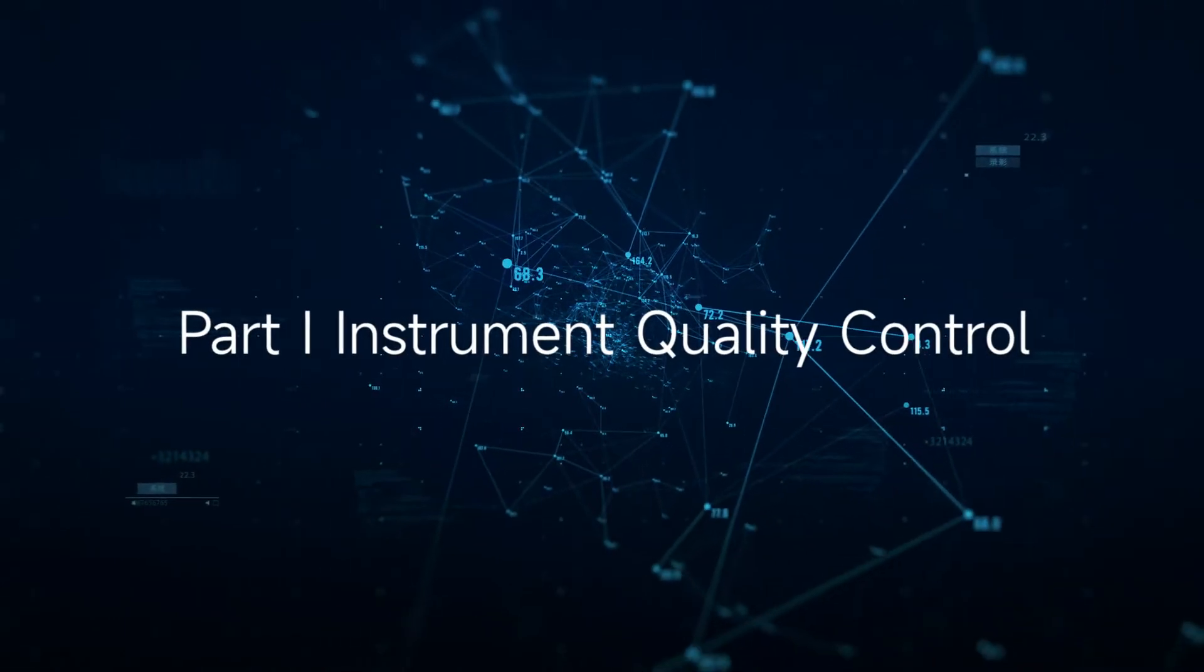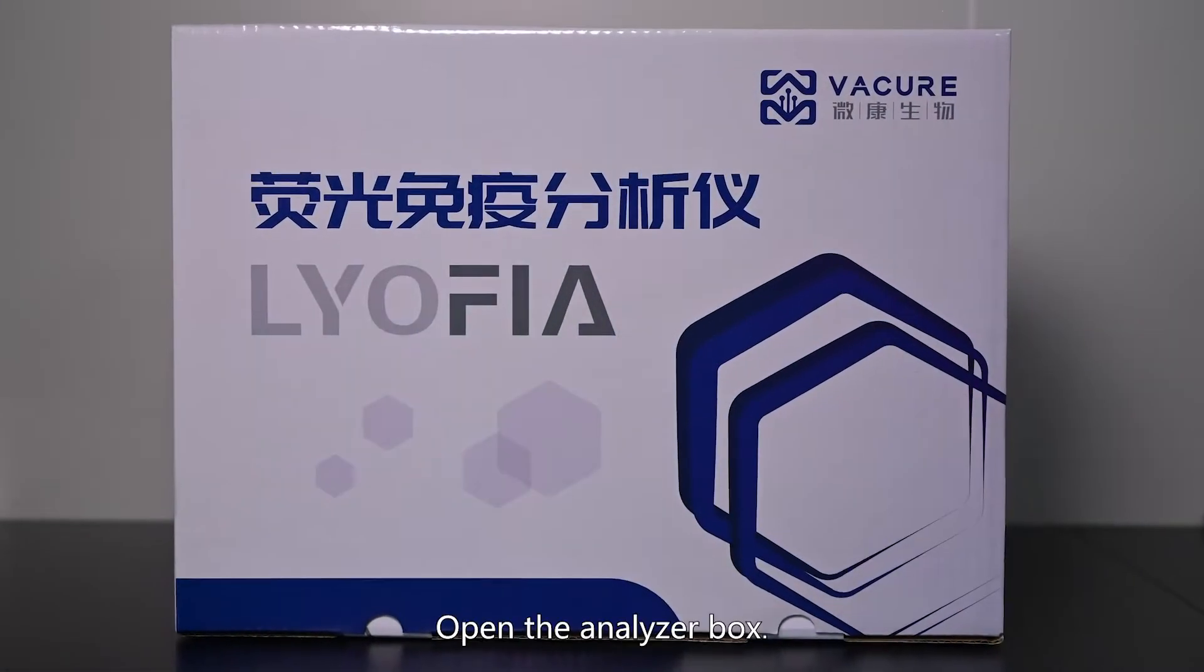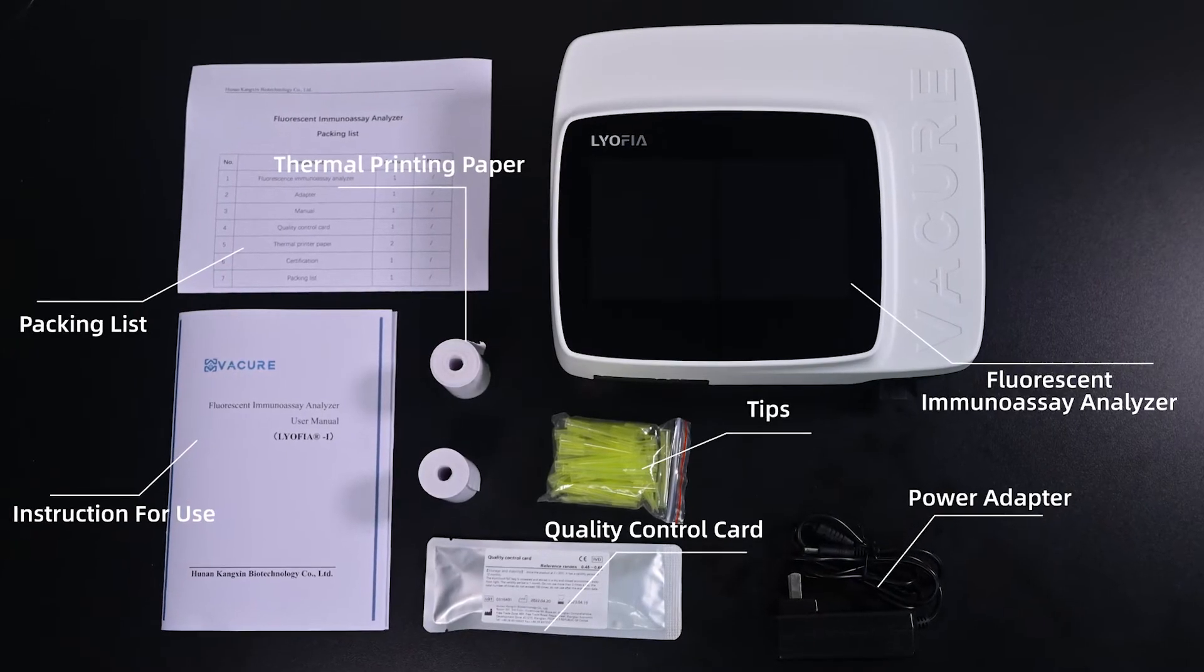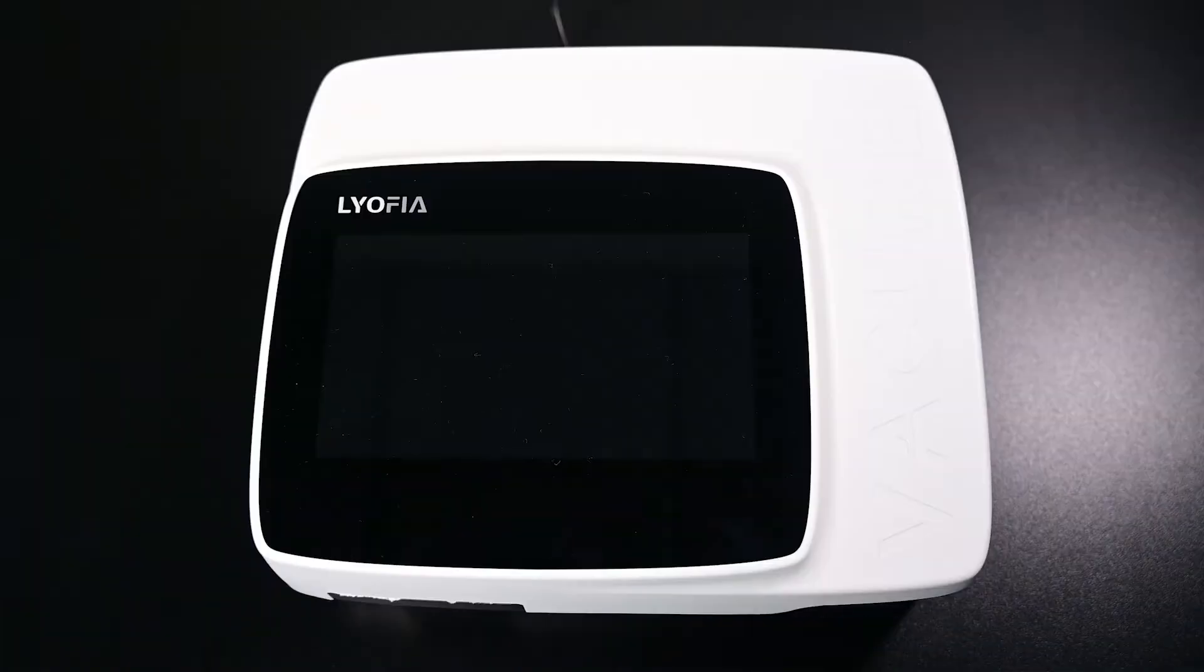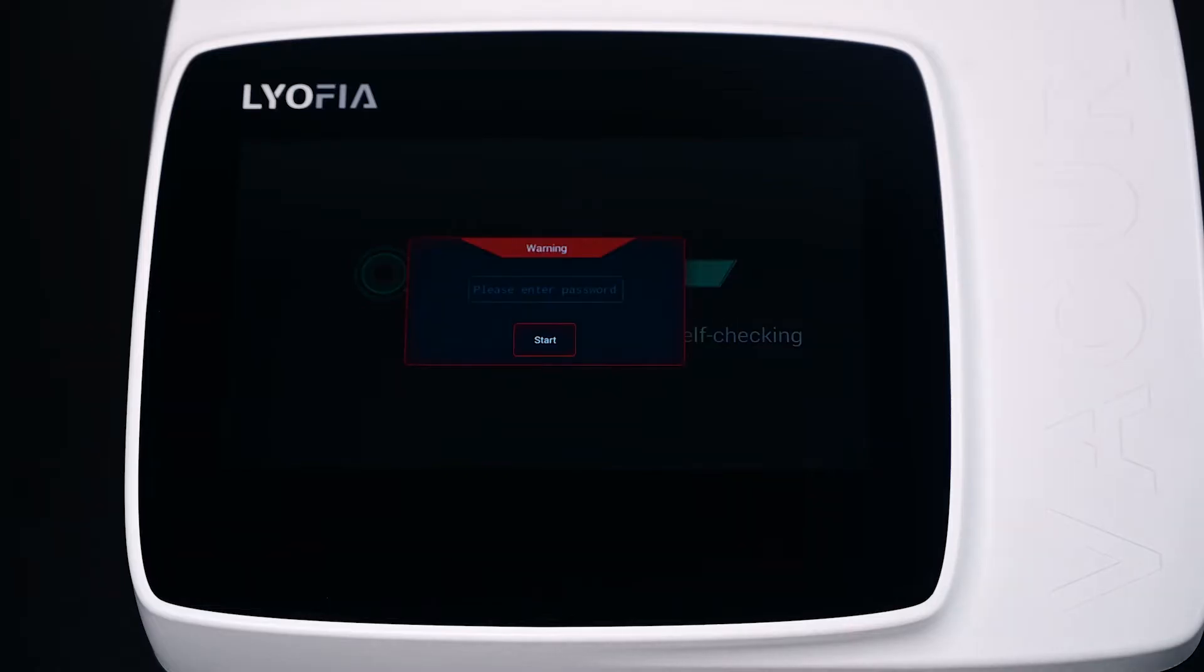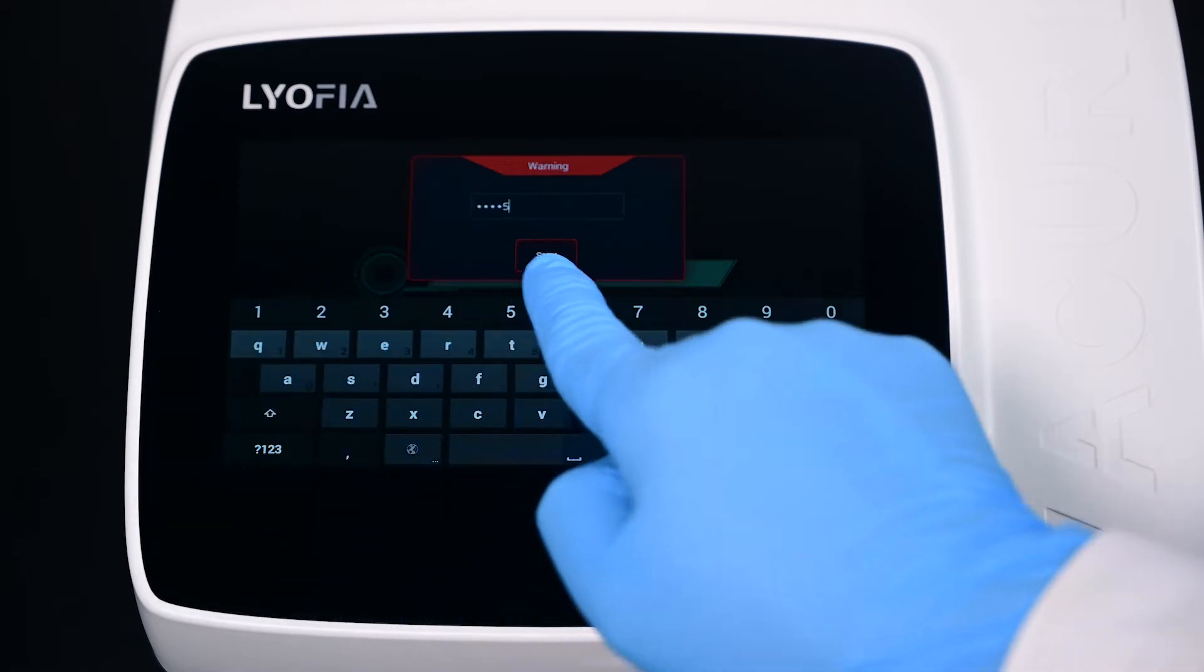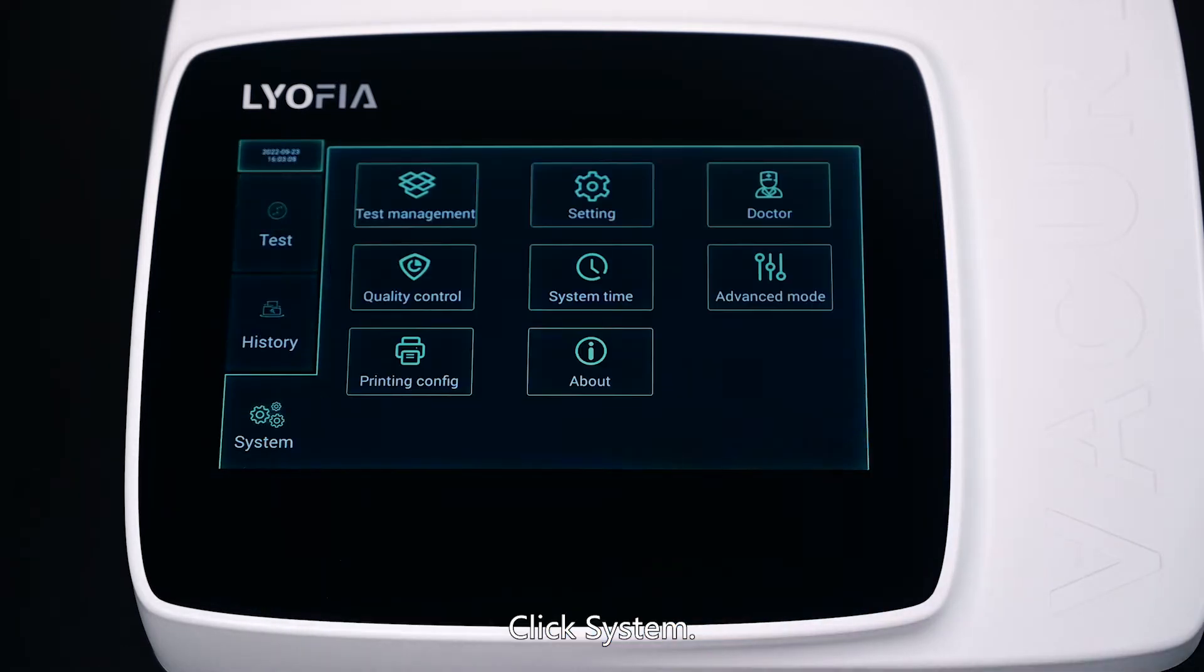Part 1: Instrument Quality Control. Open the analyzer box and power on after connecting the power adapter. Enter the password and click System.